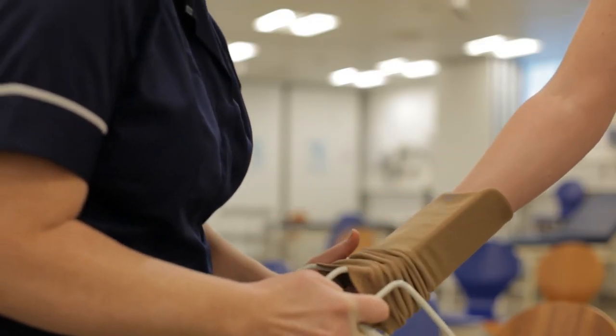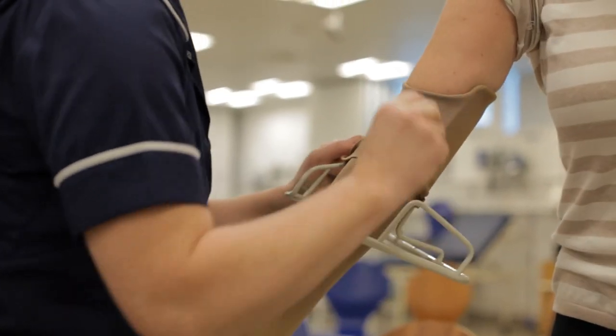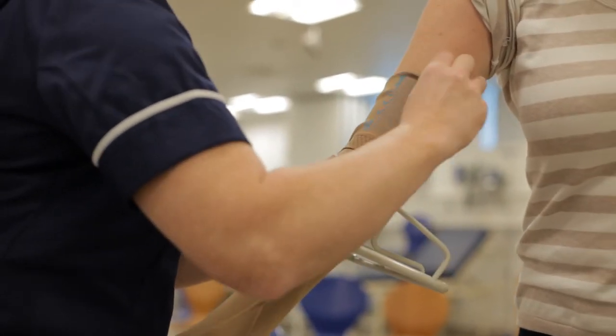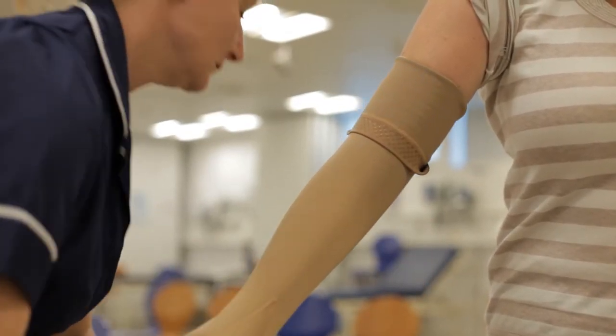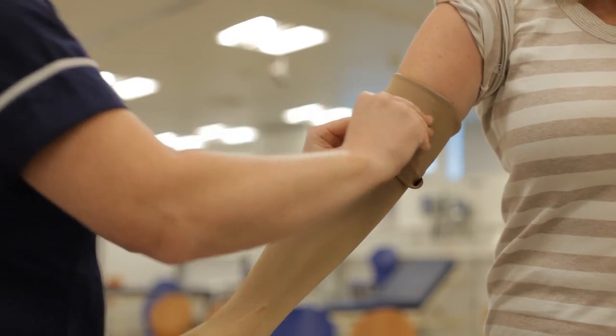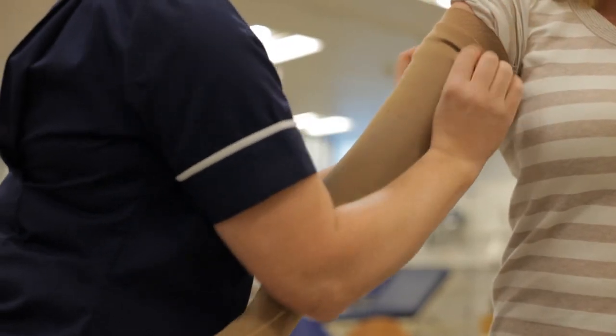You might be given an aid to help you apply your garment. This could be in the form of a cage, which is like a frame that you can stretch the garment over first — it helps you put the garment up the limb more evenly without so much effort. Or it might be a slippy sheet that can help the garment to slide up your skin. There are different ways to put on the garment and you'll find that it becomes easier with practice, and you will find your own way to do that.